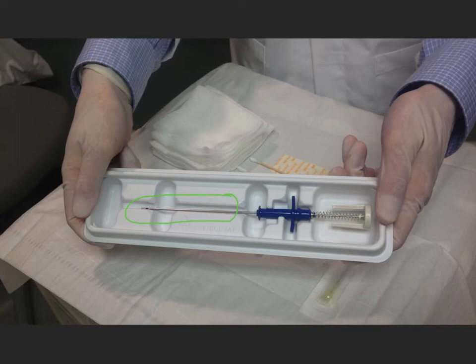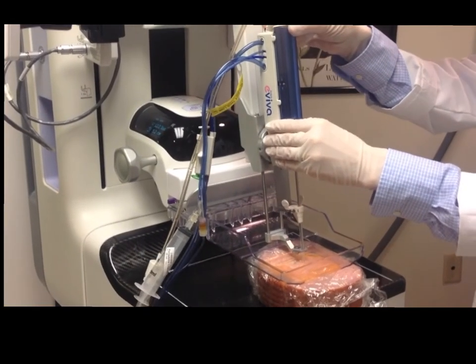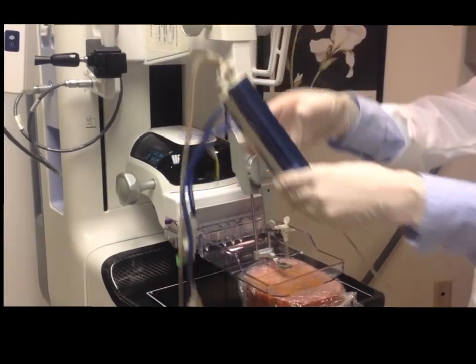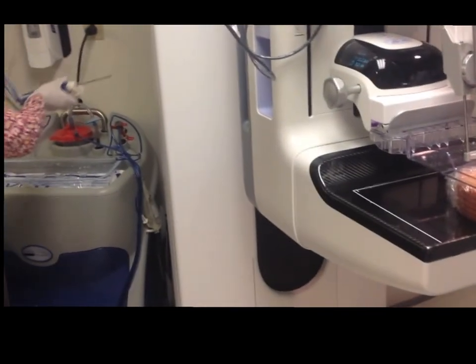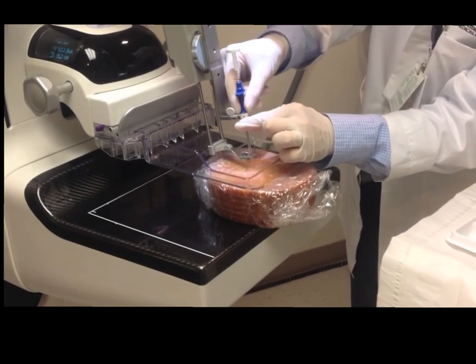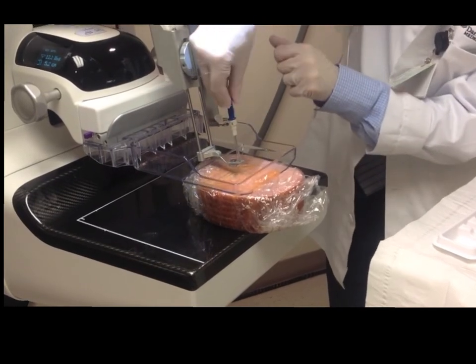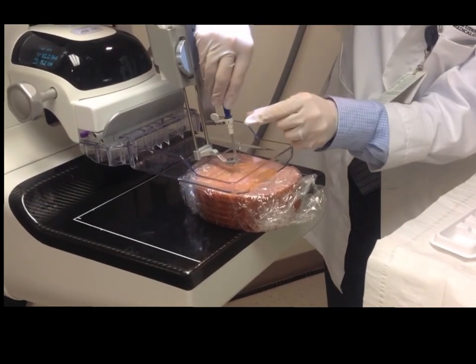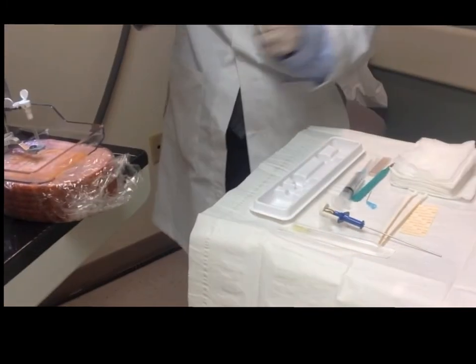Clips are deployed just by depressing this plunger until it clicks after you've hubbed the device in the sheath. So here we're removing the needle from the sheath. Just take it out carefully and give it to the technologist. We're then going to place the clip, fully engage the clip until it clicks, deploy the plunger, turn it through about 180 degrees and then carefully remove it leaving the sheath in position to take your post clip tomosynthesis view. And here is that tomosynthesis view. We have the original post biopsy one at the top. We have our clip at the bottom and we're just checking to confirm that the clip is at approximately the same level.